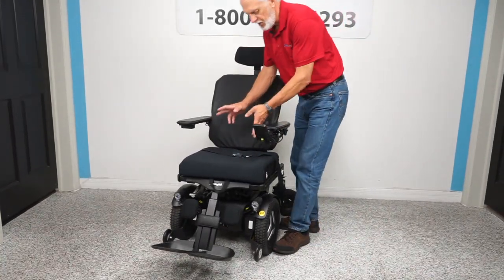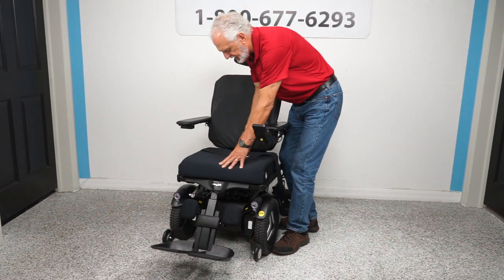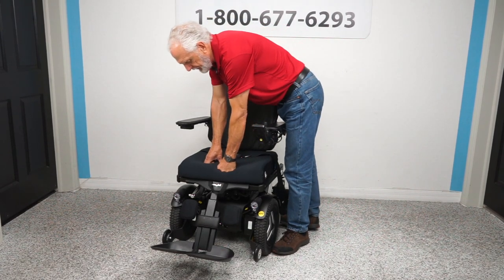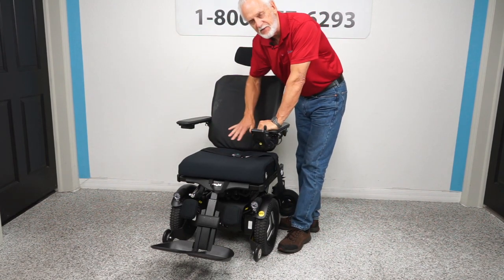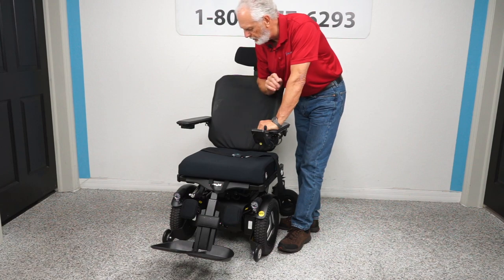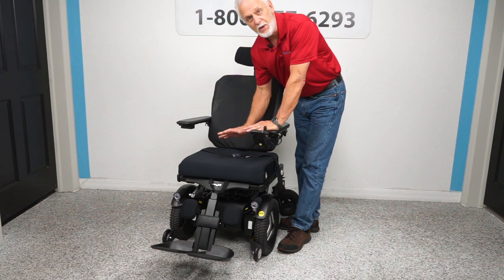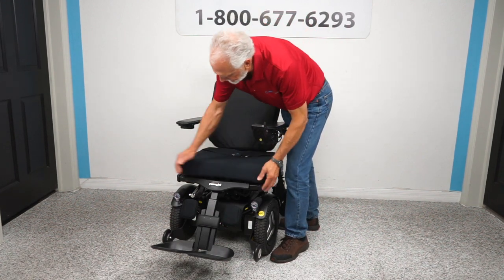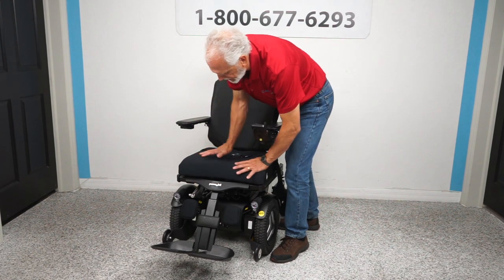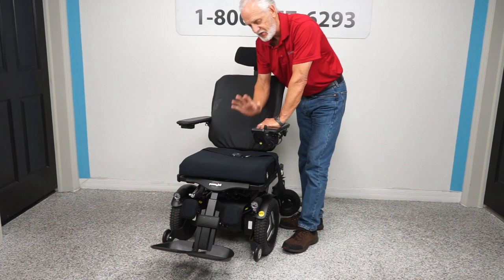One more thing about this chair: the seat is 20 inches wide by 18 inches deep. This is a memory foam cushion on the seat and on the back — so comfortable it's unbelievable. These chairs can be adjusted. If the seat is too big or too small, we can take the cushions off, expand or narrow the seat, change the cushion, and fit this chair to your body's size.